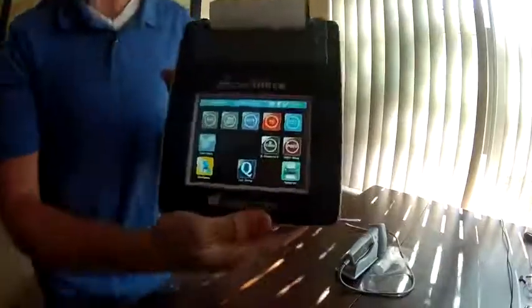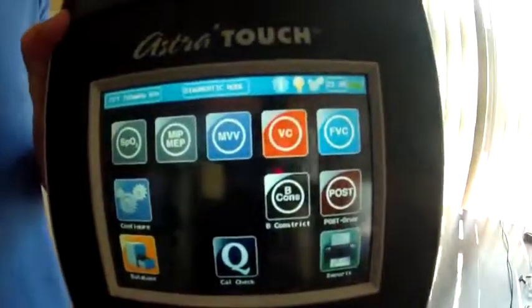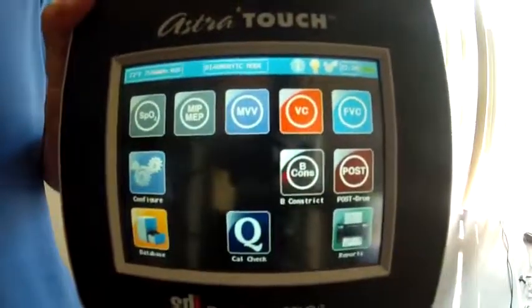Here it starts off with this screen — I want to bring it up closer so you can see. You're going to have a variety of options here, but I'm going to demo the FVC option.